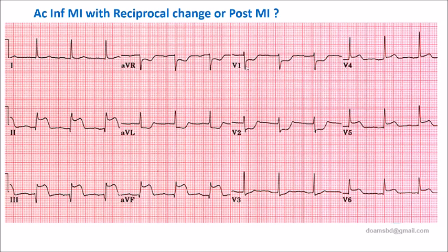So if you flip up, can you imagine that these R will be the Q and Q will be more than 25%? Possibly no. If you consider V2, forget the V1, now come to the V2. Will it be more than 25%? I think so. Could be. I'm just using the pen here. This one. Can you see the color now? So this one will be more than 25%. If you flip up, this ST segment will go up. Can it be a curved-up ST segment elevation? Yes, doctor. So two you can get.